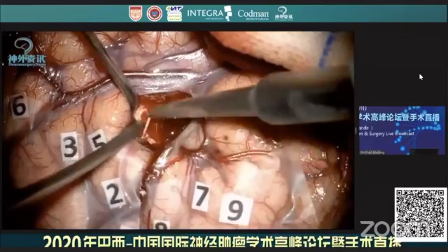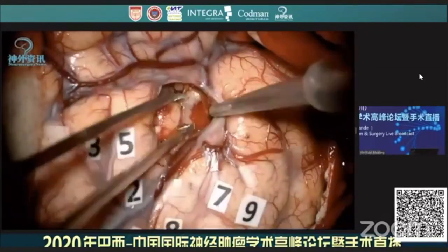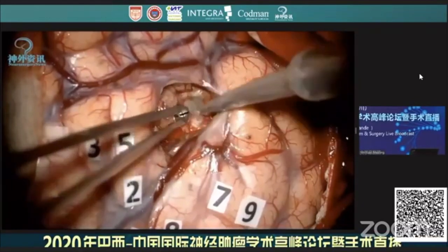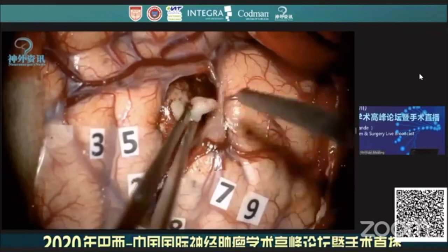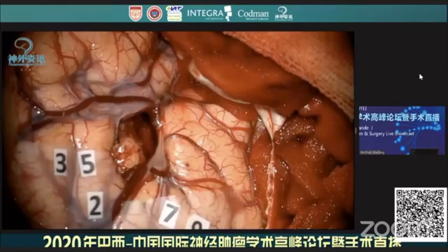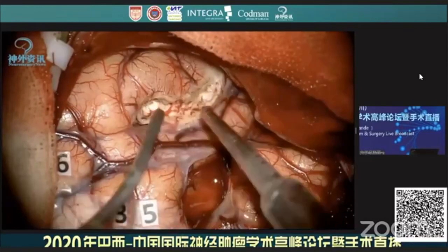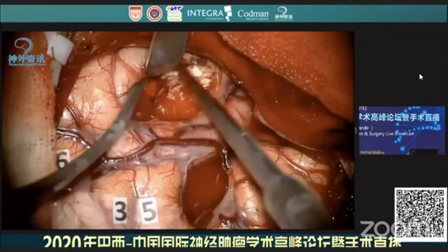Throughout the resection, the patient was routinely tested for speech, sensory, and motor function, especially when resection was adjacent to the eloquent cortex or pathways. Tissue samples were sent for frozen section. The results suggested low-grade glioma. The temporal operculum was fistulated in a similar fashion for further resection of the insular lesion in zones 3 and 4, according to the Berger-Sanai classification.